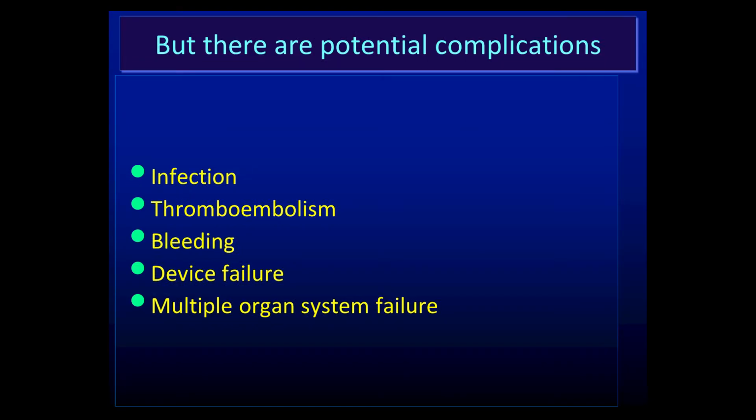Well, first of all, there are potential complications. And here they are. They can get infected. There's a thromboembolic risk. If this catheter is sitting in the left atrium, that thromboembolic risk can go to really bad places. There is potential bleeding with all these catheters. They can fail. There's the potential for multiple organ system failure. The Impella is spinning these red blood cells really fast. Your platelets get chewed up, and there's hemolysis, and you get all the potential trouble. So you actually can get in trouble with these complications. And as you might figure, the longer you leave them in, the larger the incidence of complications is.